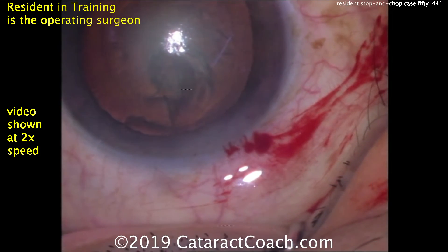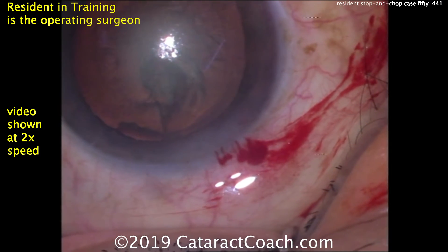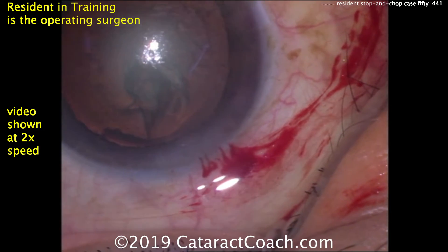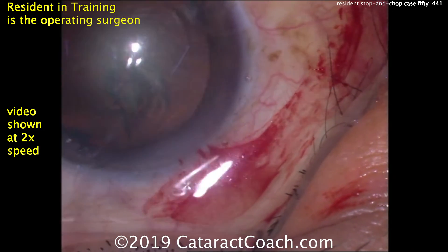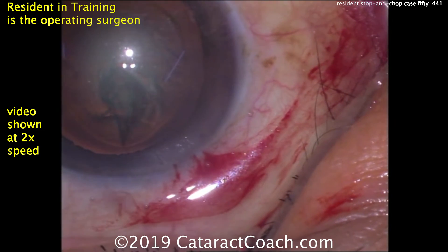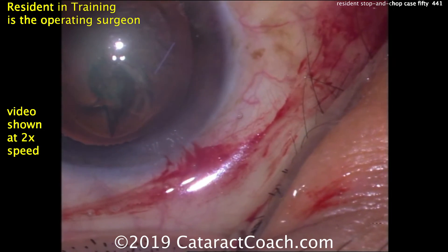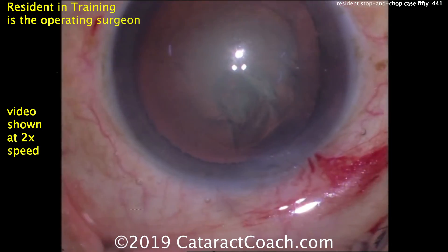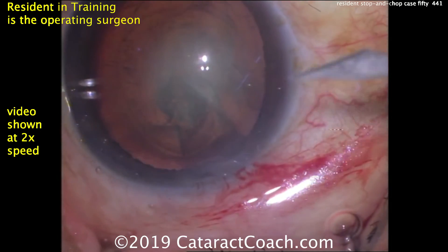We are showing the whole video today at two times normal speed. This video is about nine and a half minutes in length; the original unedited video was about 19 minutes. This is a resident who has done about 50 cases so far — this is case 50.